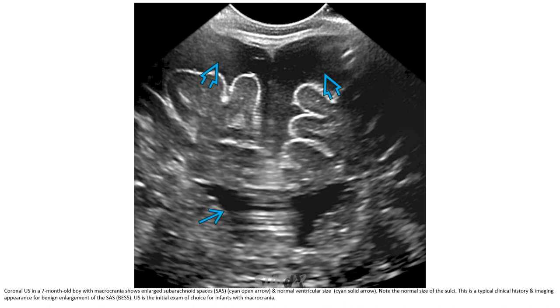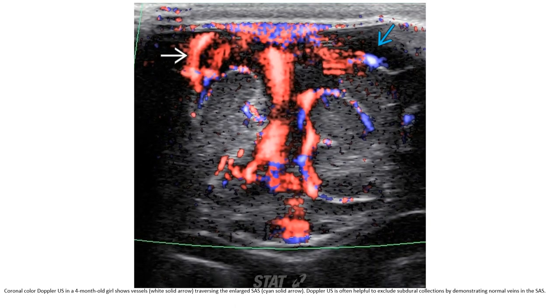Ultrasound is the initial modality of choice for infants with macrocephaly. This is the color Doppler ultrasound in a four-month-old, demonstrating large subarachnoid spaces. Color Doppler is often helpful to exclude subdural collections by demonstrating vessels coursing through the subarachnoid spaces.